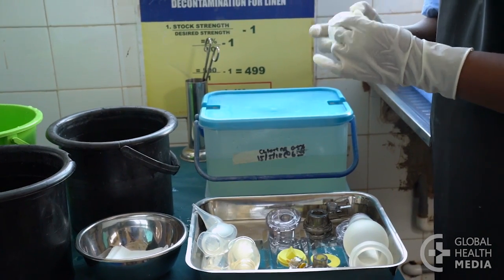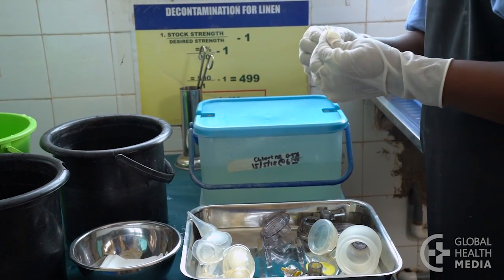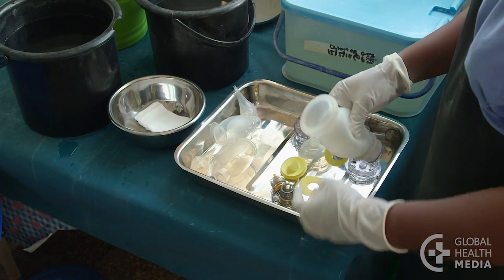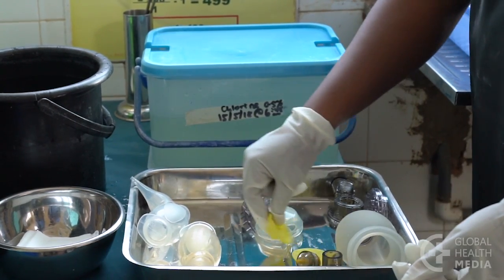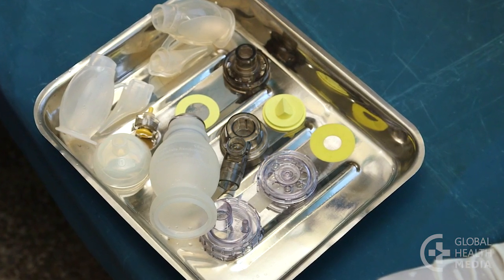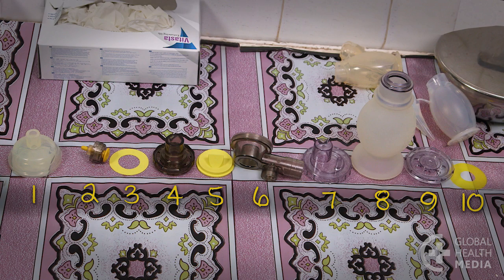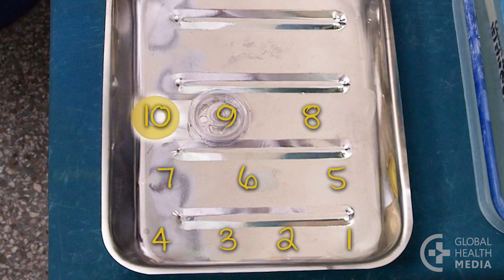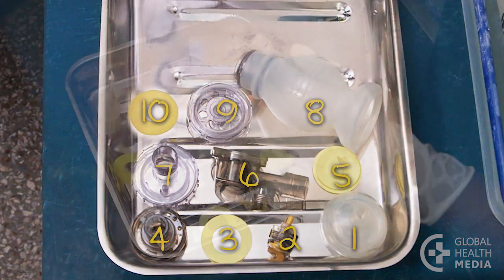Put on sterile gloves and dry each piece inside and out with sterile gauze. Now you've disinfected the equipment. Wearing sterile gloves, inspect each piece for damage and then count the pieces for each ventilation bag. Repeat the cleaning process if they are not clean, and replace any damaged or missing parts. Next, put the bag back together. Remember the order you took them apart, then line up the pieces in the opposite order. Start with the last piece.